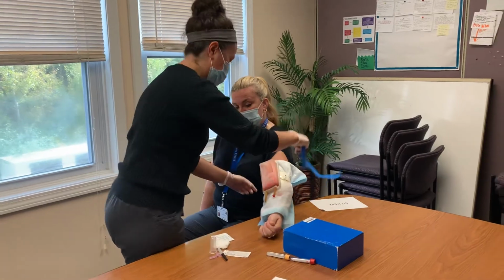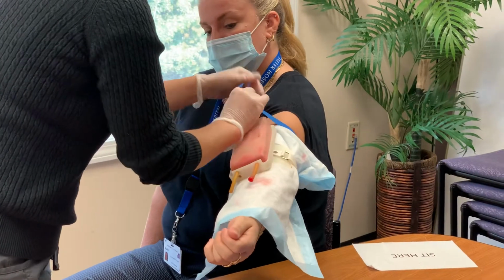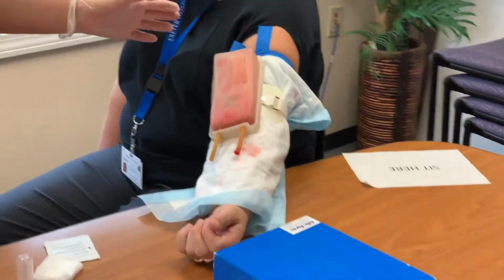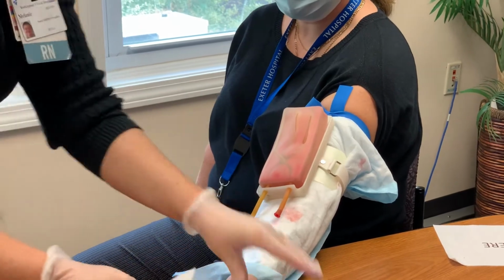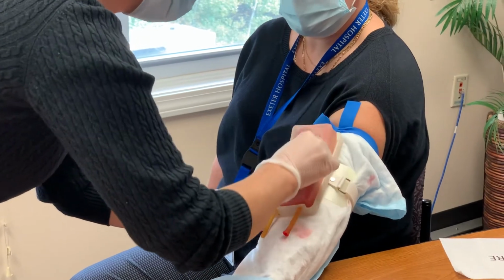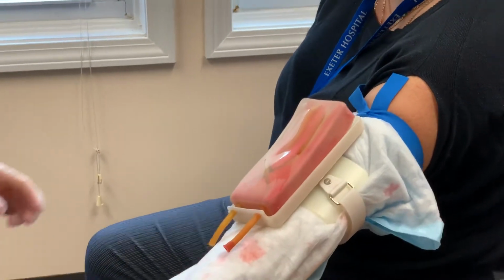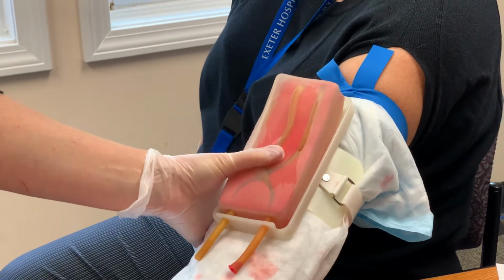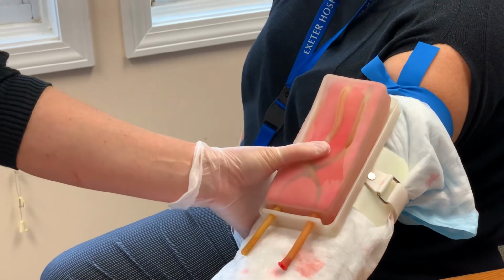I'm gonna apply my tourniquet. Never apply it for more than a minute. You're going to be cleaning the site. Now some people have very thin skin or rolling veins. So when you're drawing, you're really going to want to make sure that with your other hand, you're pulling back to taut the skin to kind of stabilize the vein.